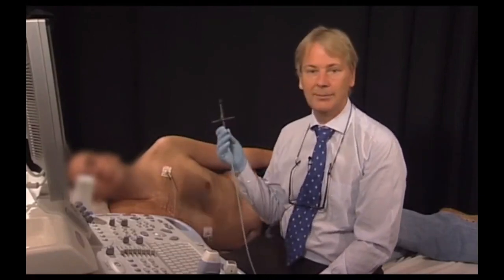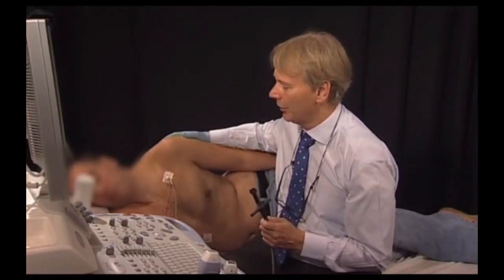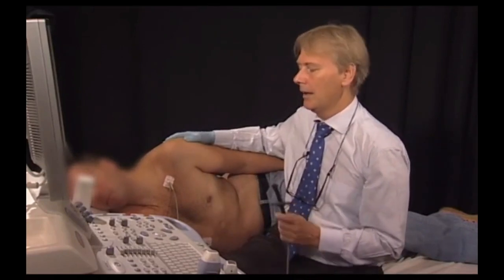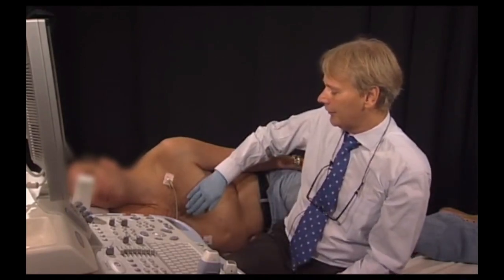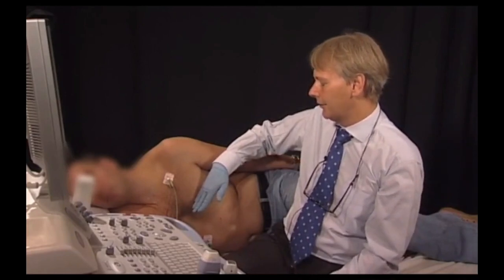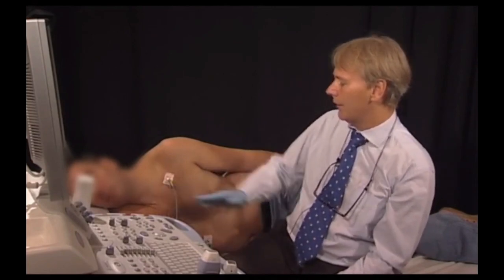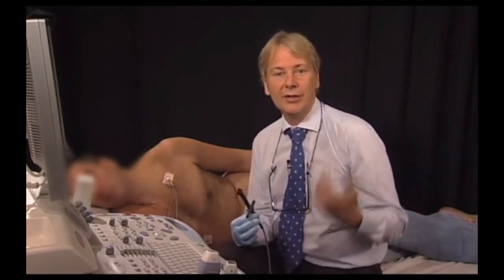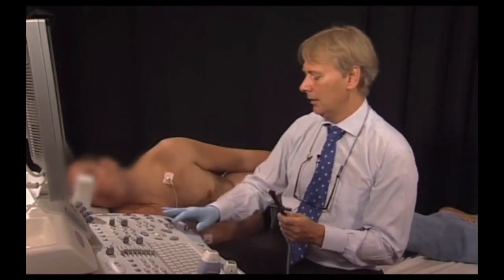To quantify aortic stenosis from the right parasternal approach, we also need the pencil probe. It is important to position the patient turned as far as possible toward the right. We have to remember the anatomy of the heart and where we can expect the jet to be — the heart is on the left side and the jet can go in many directions, fairly flat or fairly steep toward the head, so we have to try multiple positions and windows to find the optimal signal and maximum velocity.